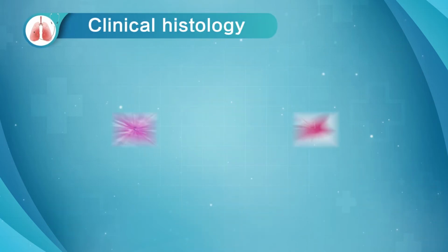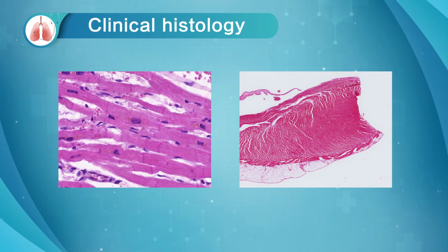Now, let's recall what we have learned about the cardiac muscle fibers. They are branched and joined with each other end to end by intercalated discs, as we see on the left.